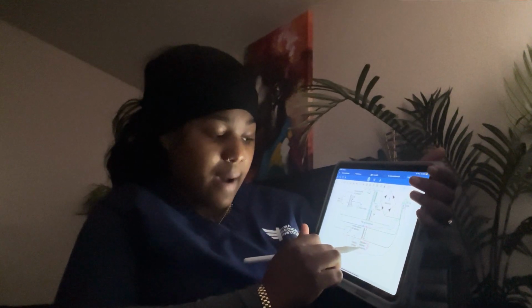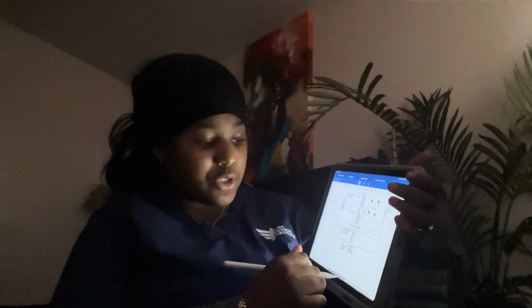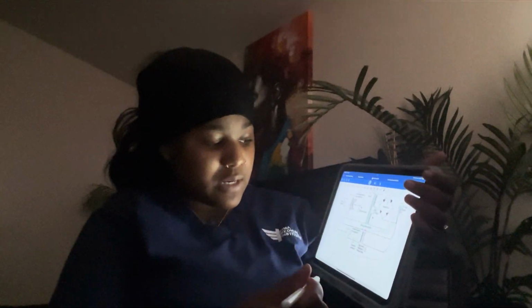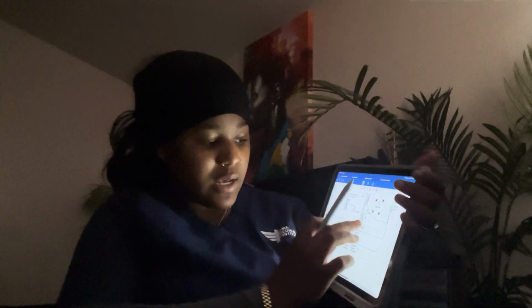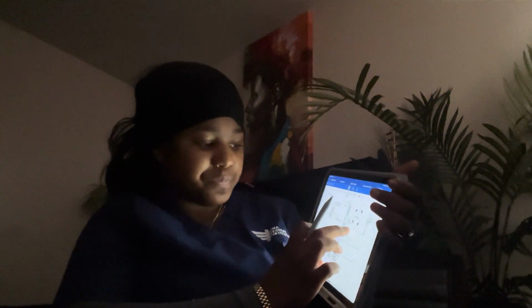The step down is going to be opposite from the step up transformer. Once we step down the filament, it's basically bringing you back down to the low voltage side. So that is the more fundamental part of the step down transformer, which is also a very important part.